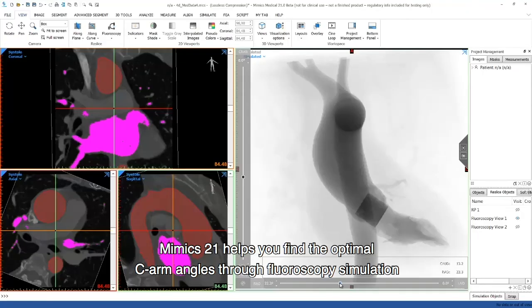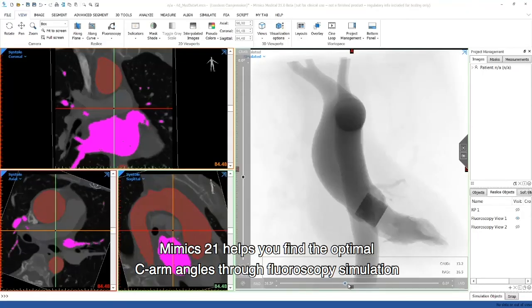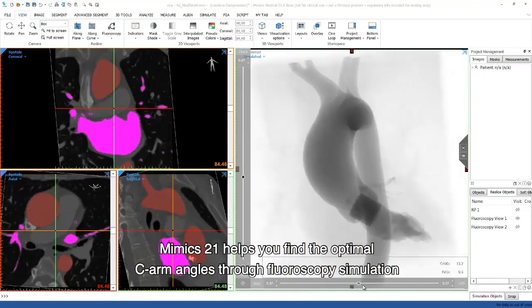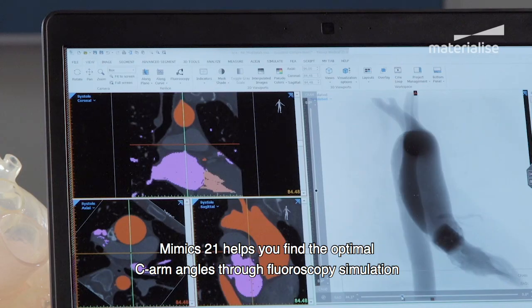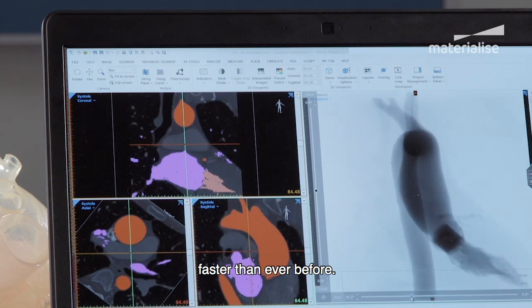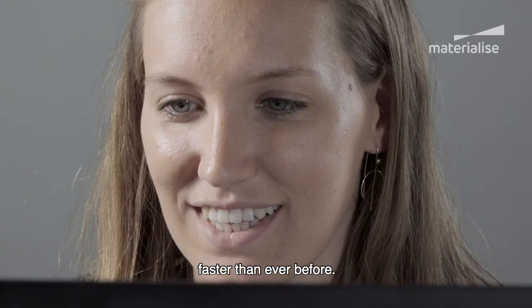Mimics 21 helps you find the optimal C-arm angles through fluoroscopy simulation faster than ever before.